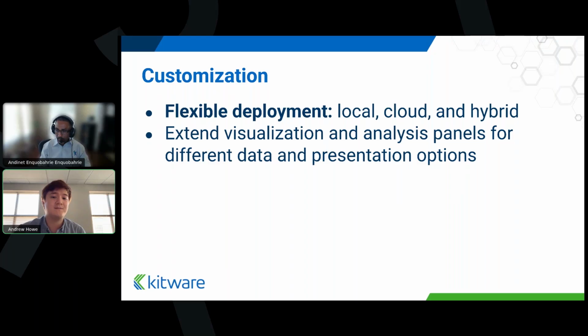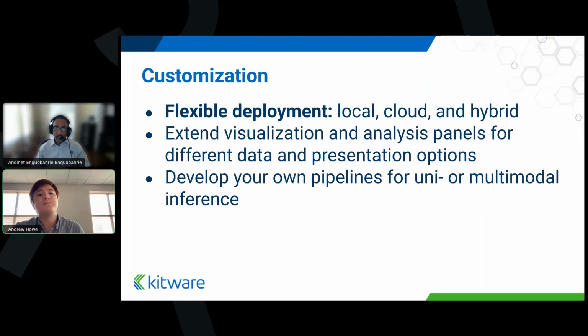In VolView Insight, we use Vue. If you're not familiar with web dev, don't worry about it, but basically we use Vue's Composition API, and that allows us to organize each component's logic. So that means you can easily create and reuse custom composable functions that allow you to process and display any sort of EHR data exactly how your workflow requires. This can be lab results, physician notes, allergies, etc.